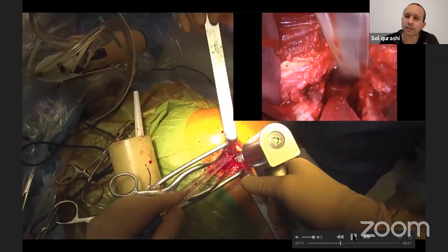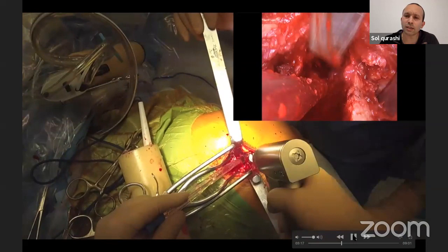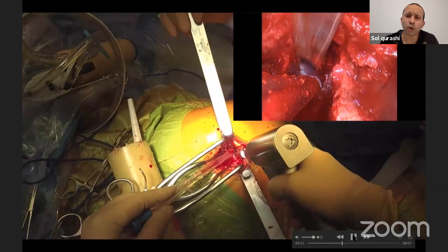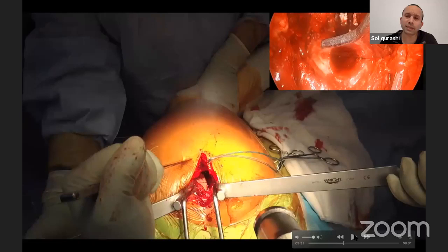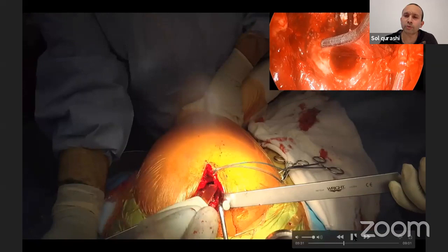You're in the joint, as long as you don't push it in too far, you're pretty much safe, there's nothing there. And there's Homans in front of and back of the femoral neck. So they're protecting everything else. So that being done, to make it easier for me to get the head out, I was a bit worried in the first couple of years, why doesn't my head come out as easily as it does in the animation? So now I just take out a little wedge that gives me a bit more maneuverability.